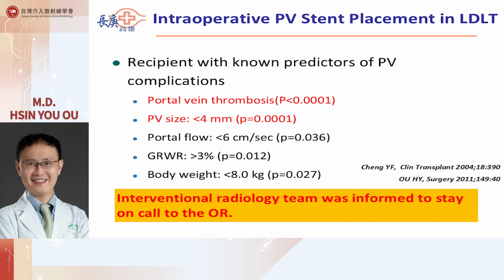The first question is, what is the indication for the intraoperative portal vein stent? Actually, there are some risk factors for portal vein complications during liver transplantation. The most important is previous portal vein thrombosis, like our first case. There will be poor quality of the portal vein, and after the anastomosis there is a high chance of inducing portal vein thrombosis after liver transplantation.